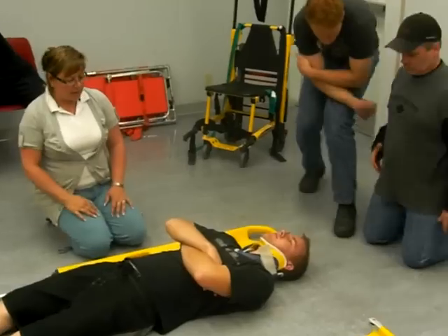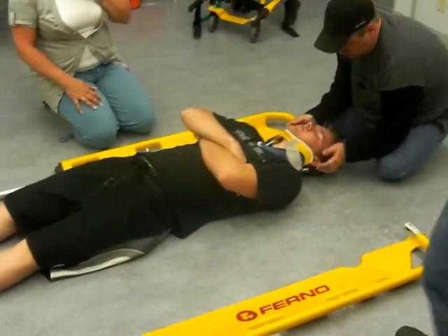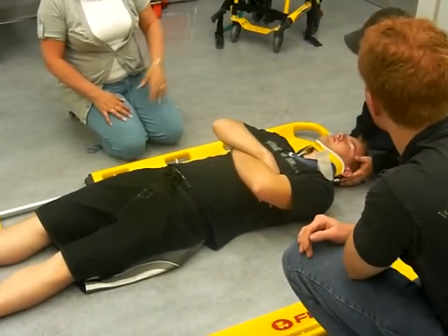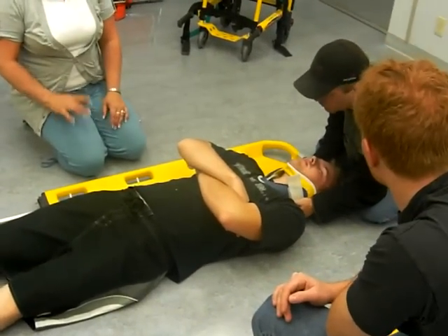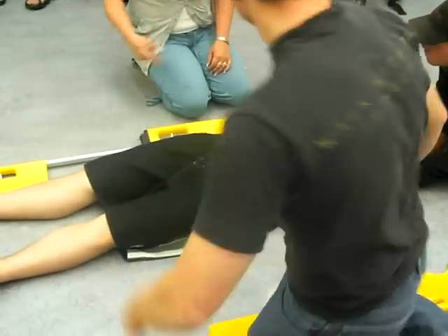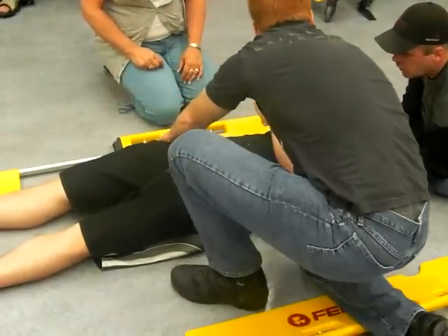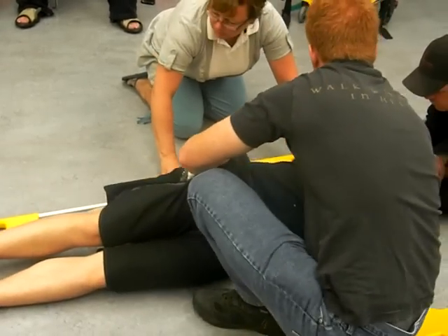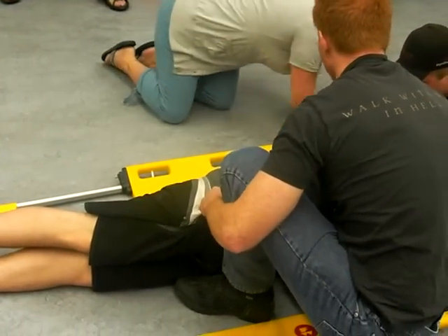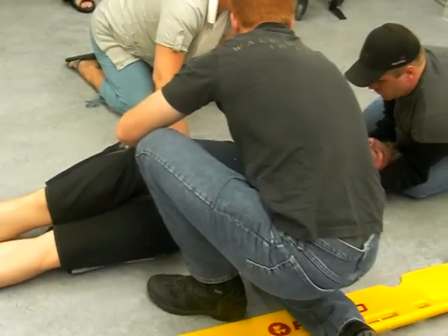Okay, you want to do a log roll? Devin, you want to go on the other side? Elbows on your knees, you're going to roll. Which way do you want to roll first? Which way are you going to go long? We'll go that way. Devin, you're going to grab the hips and shoulders, you're going to roll them towards you — just a little bit so I can put this underneath there.